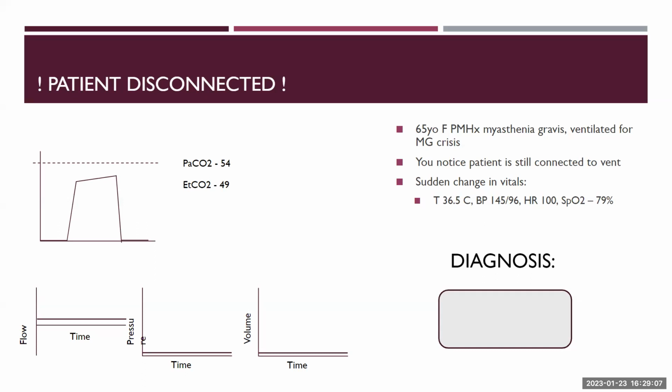We have a really elevated end tidal. Is this apnea? I don't know. The flow curves seem flat. And then the end tidal's super high. So are they not breathing?